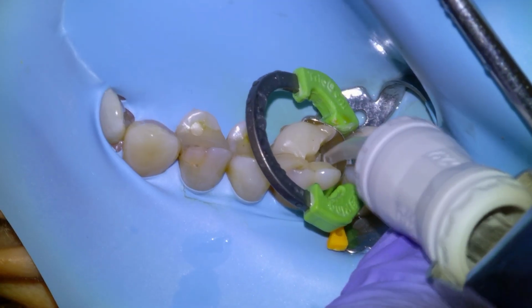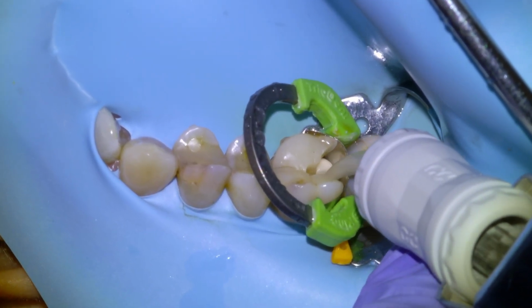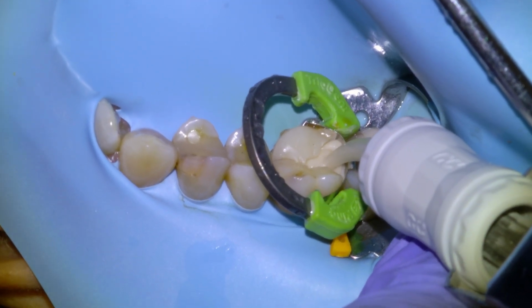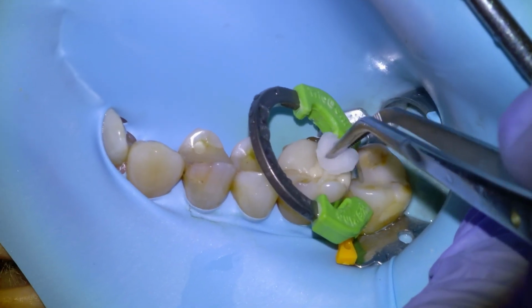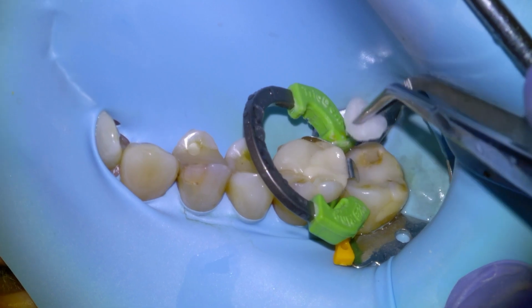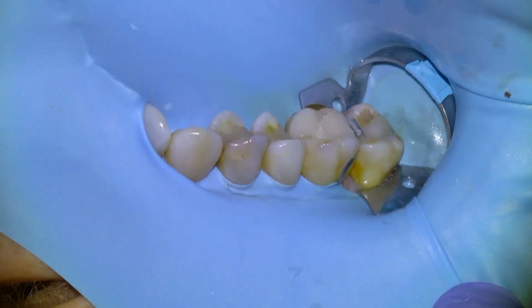I'm a huge fan of Equia Forte. Been using it a lot for about the last 2 years. This material came out about 4 years ago from GC, and it is indicated as a definitive load-bearing restorative material. Gonna overfill the cavity and pack it down with a moist cotton pellet. Wait about 4 minutes for it to set, and then disassemble our matrix.